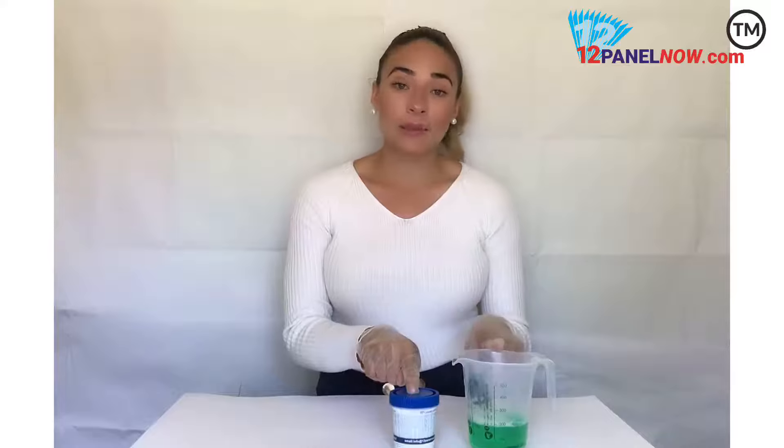To start off, you would have to remove the drug testing cup from a sealed pouch. After that, you have to collect the urine sample in a small container. Make sure that the room temperature is between 15 and 30 Celsius.